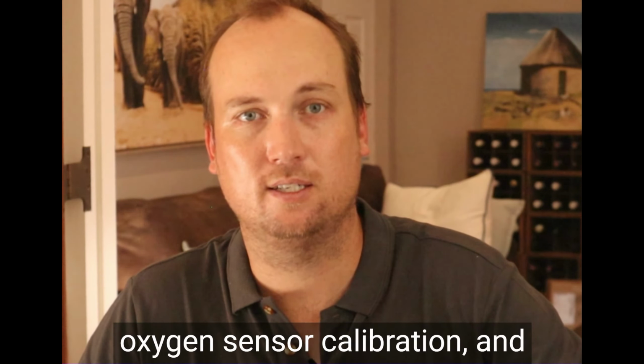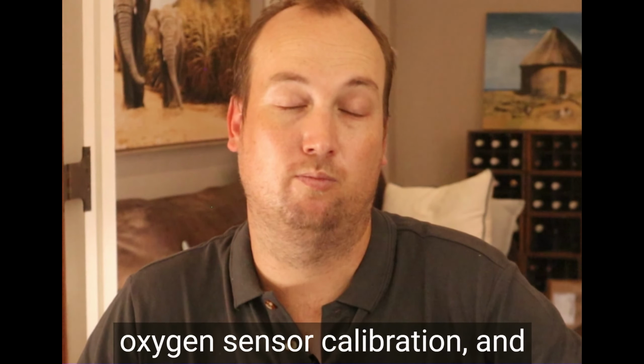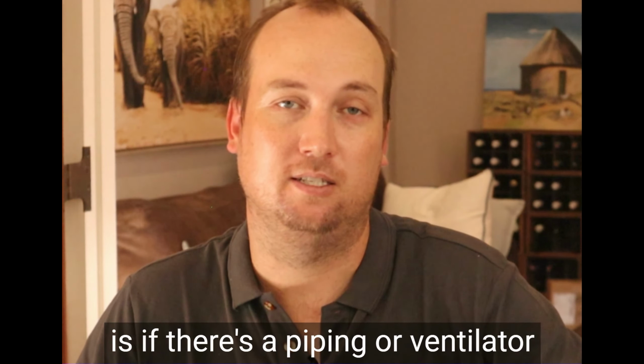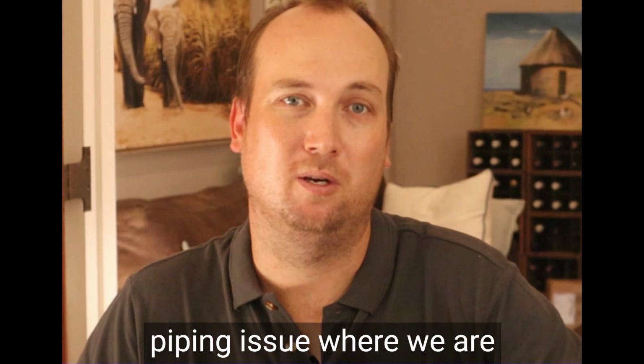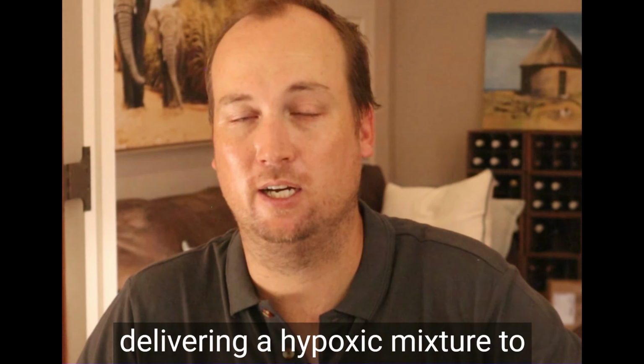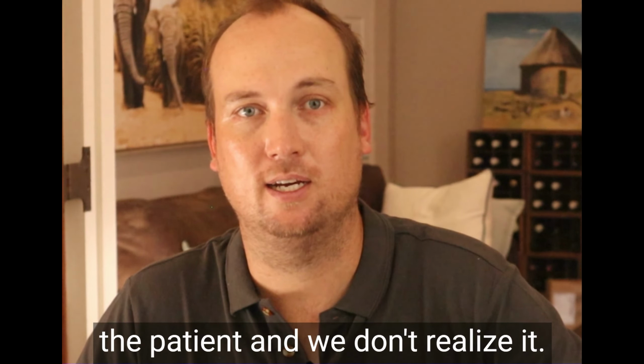There can be issues with the oxygen sensor calibration. And probably the most worrying one is if there's a piping or ventilator piping issue where we are delivering a hypoxic mixture to the patient and we don't realize it.